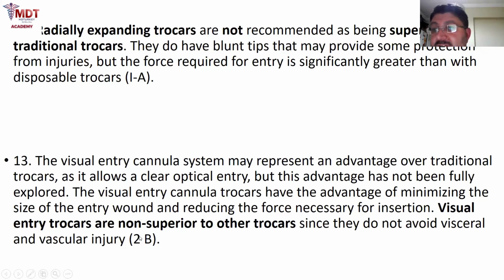I have once used this visual entry trocar, and it's not an easy and a fast technique, and they are not superior to other trocars. They have recommended these 13 recommendations. Yes, this was the last slide.